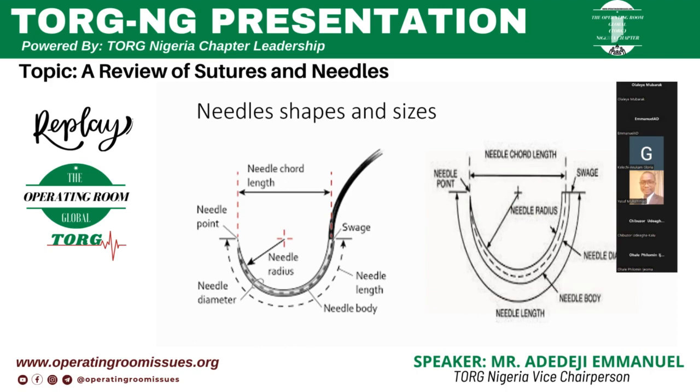For surgeries like eye procedures and vascular procedures, we use 8-0 and 6-0. For vascular procedures 6-0, for eye procedures we use as low as 10-0, which is the lowest, and of course the highest is 10, which I don't think is commercially available. What we have seen commercially is 2. I don't know, maybe in other parts of the country we've seen anything beyond the ones that I've mentioned.